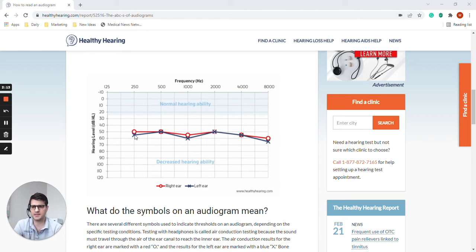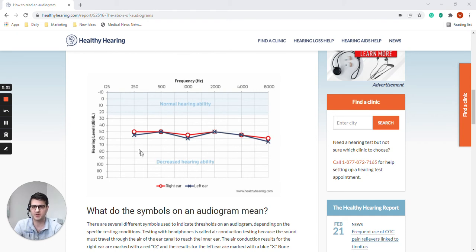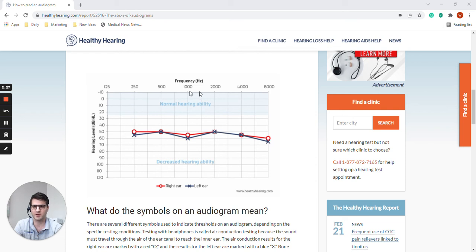So anything above, well I should say below these, this line here is considered audible. They could hear any sound that might exist in an environment above here, which would be softer. This person could not hear, could not detect.